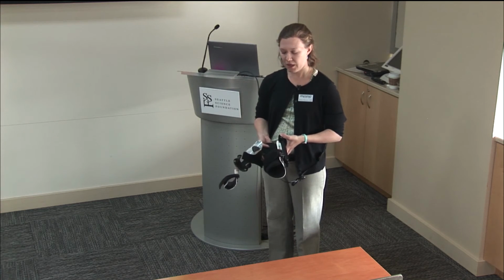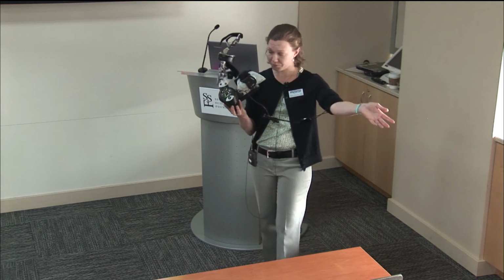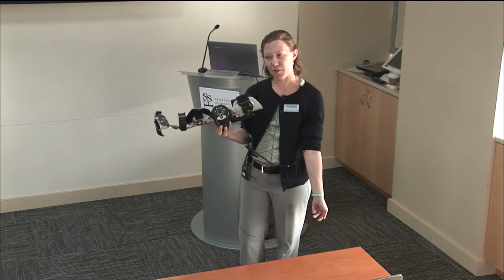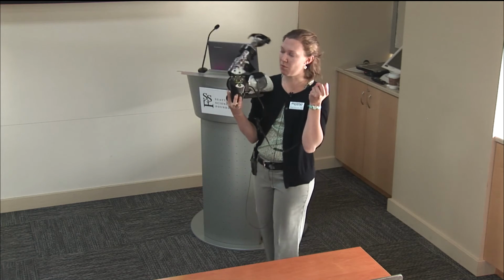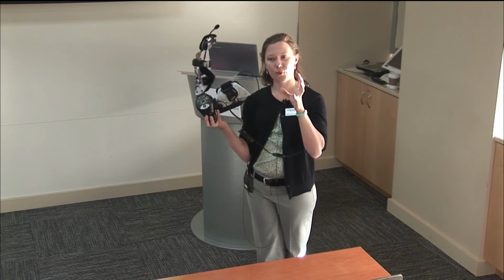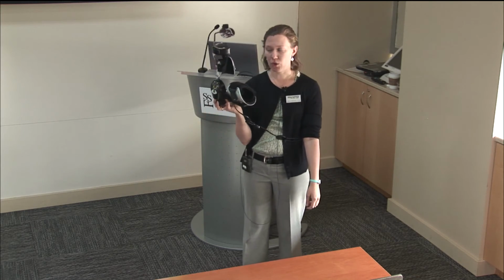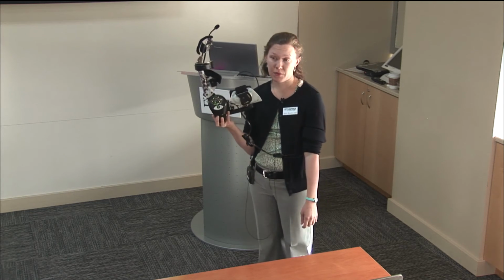But as you can see, this is a device here. I do have the sensors on my other arm here. It is very responsive to my needs and to what I input into it. So if I engage my triceps, it will extend all the way out to 0 degrees full extension. If I flex, it will come up to full flexion at 130 degrees. For patients who have gone through training with an OT and get very good at this, they can actually stop at mid-range of motion. So they'll have the ability to hold it at 90 degrees or 45 degrees or something of that nature for the task that they're completing.